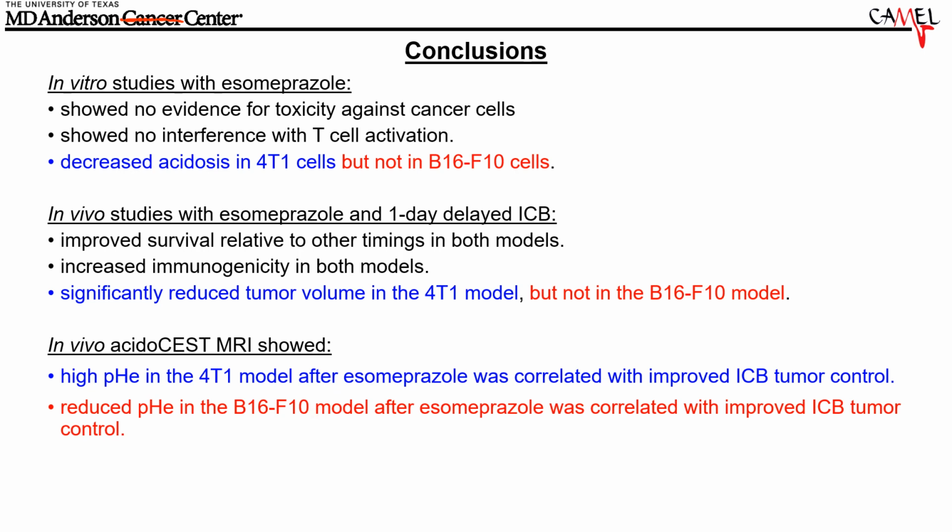So this shows promise, but not all tumors are going to be uniformly affected by the concept of a pH sensitizer to improve immunotherapy, as shown by acidoCEST MRI.